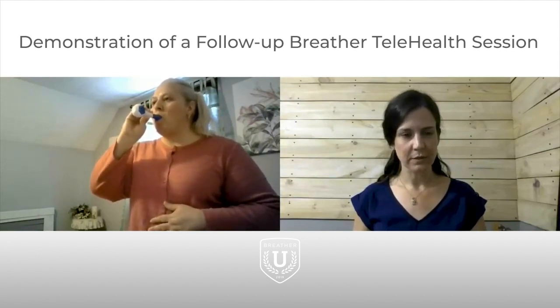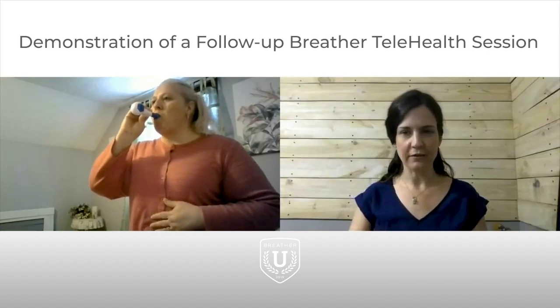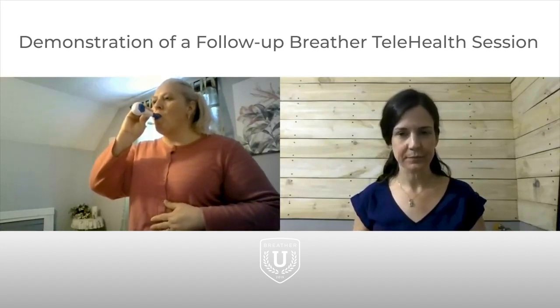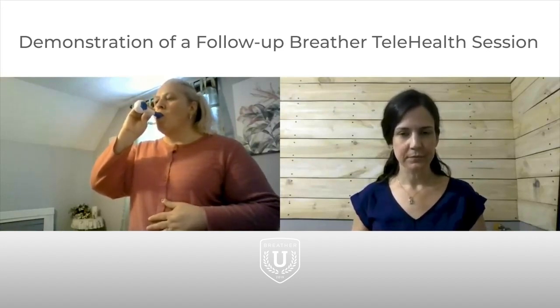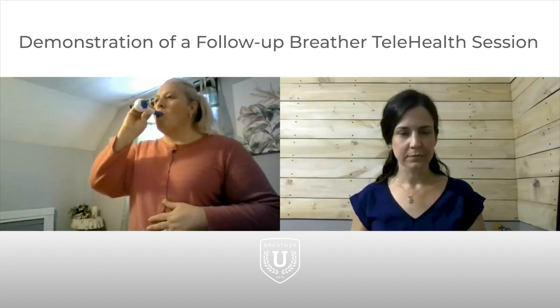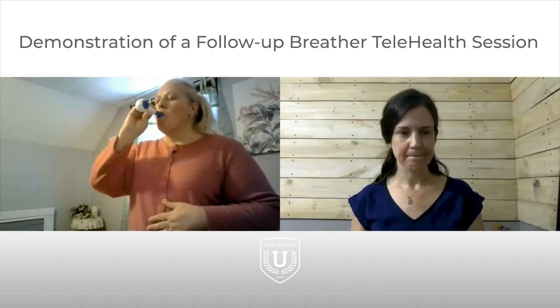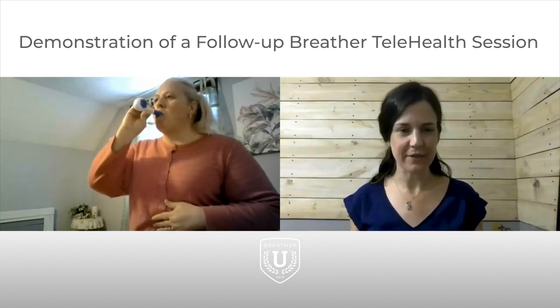Good. Make sure you're pushing it all out. Good. Halfway. Look at that diaphragmatic breathing. Nice.